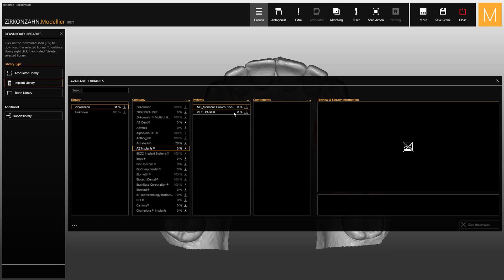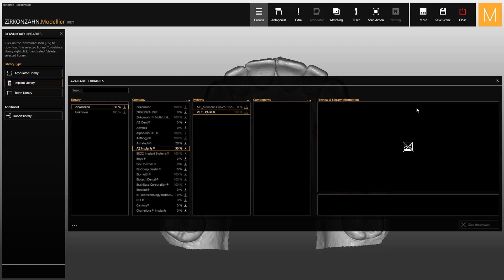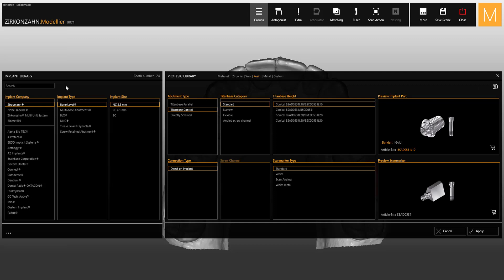Once the download has been completed, the implant library has been updated and you can choose the system as well as the prosthetics components needed.